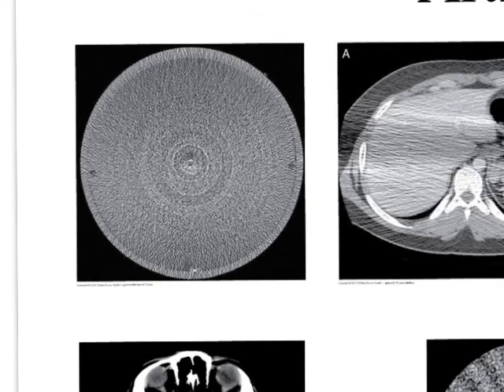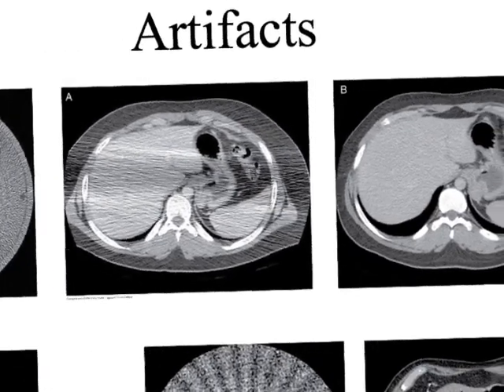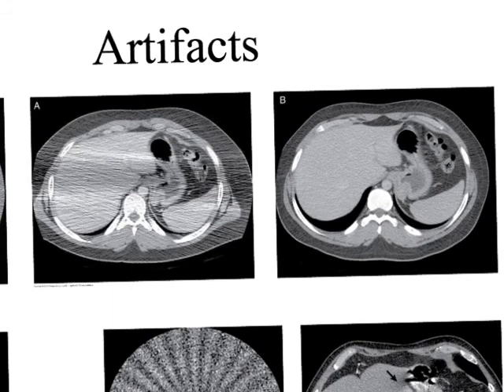Here's another one that is very impactful to us in radiation therapy. You'll probably see this artifact quite a bit. We're going to call this an out-of-field artifact, right? This is an out-of-field artifact. These images are on the same patient at the exact same level. Can anyone guess what has changed between these pictures? Was it something they were wearing? That's close, but it's this. This versus this, right? Wow.